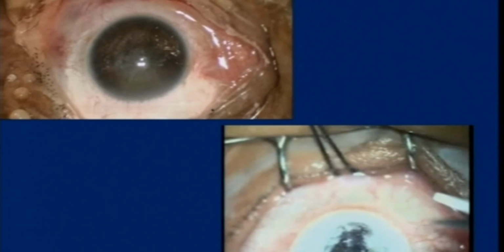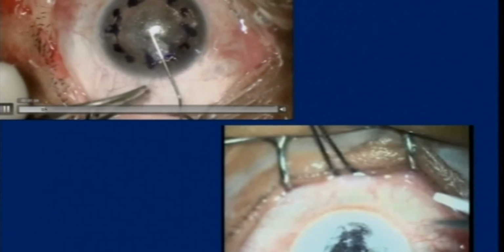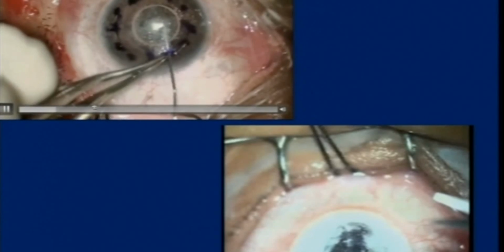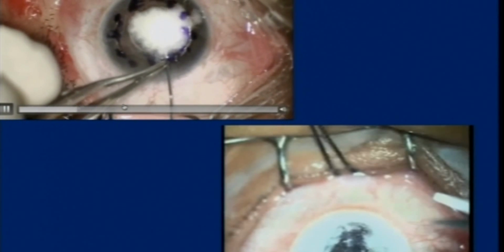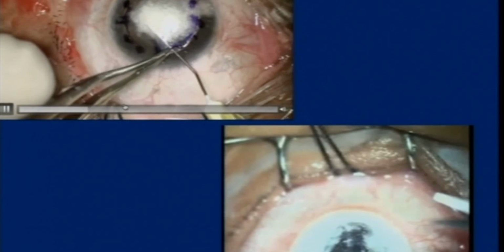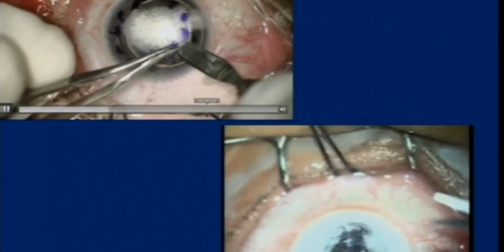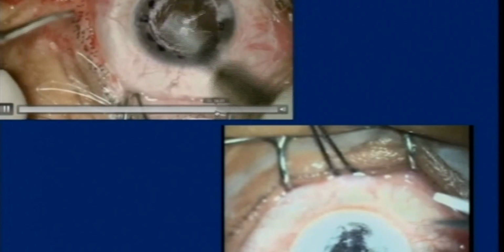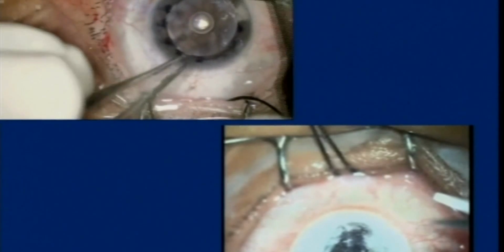And this is another case of macular dystrophy. This particular case had perforation right at the beginning. It was a very soft eye, a post-vitrectomized eye. I injected an air bubble directly into the anterior chamber. Then I changed the direction of the needle, and I injected air into the stroma, and I could complete the procedure by doing a manual dissection, and the patient did well.